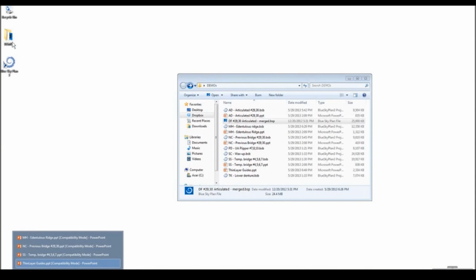Do you have a picture of the scan appliance that you're able to bring up? Or can you describe a bit how it's done? Is it done by you, or could the dentist do it? It's done by the surgeon or by the surgeon's lab. Basically, it's a suck down using 060 soft vacuum-forming material. You have to block out all the large undercuts. We have pictures and protocols on our website. The smaller undercuts won't be such an issue.